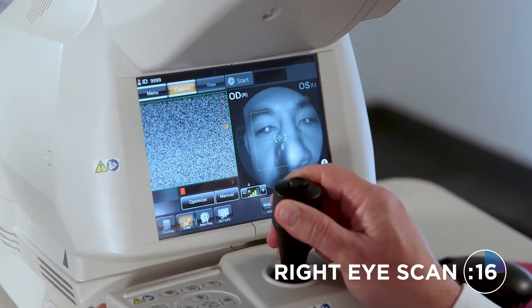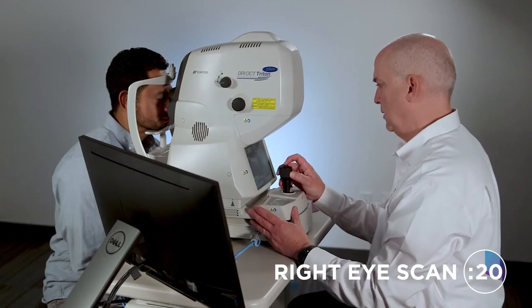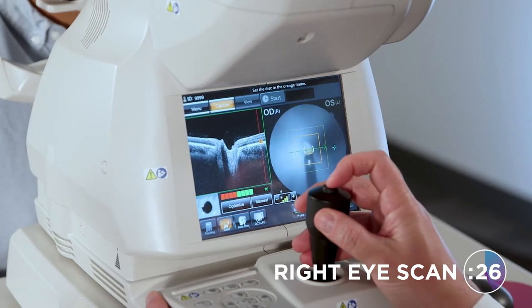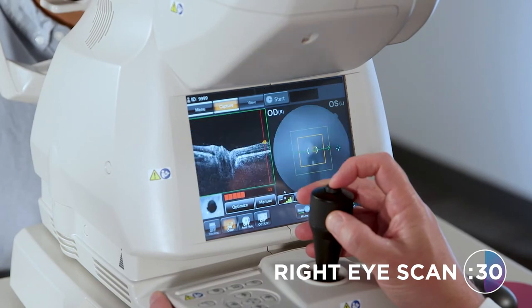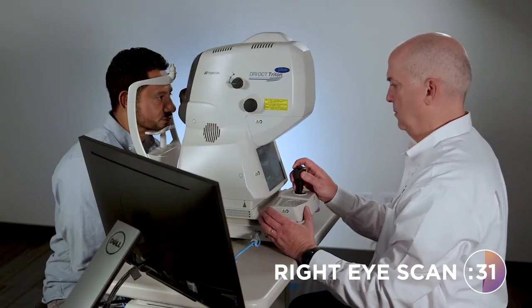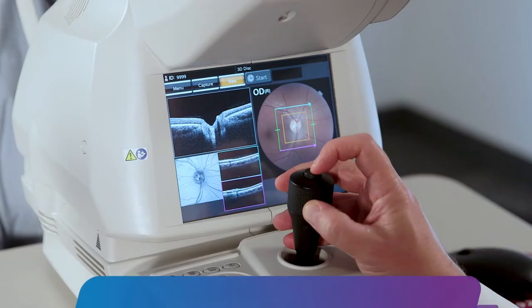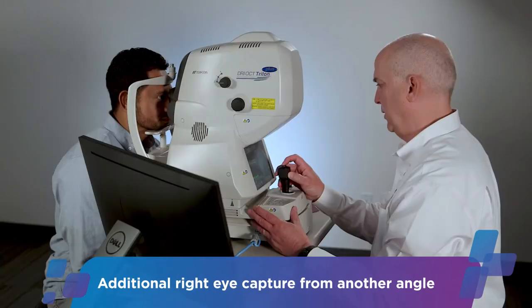We can now begin to scan the patient's eye. We move the Triton into the eye by pushing the base towards the pupil, making fine corrections with the joystick as we go. We line up our two eye distance circles in the middle of the parentheses where they turn from orange to yellow to green once proper distance is set. We check the real-time signal strength, take note of the fundus image, and eliminate glare crescents as needed. We coach the patient to look at the center of the green X and blink normally.